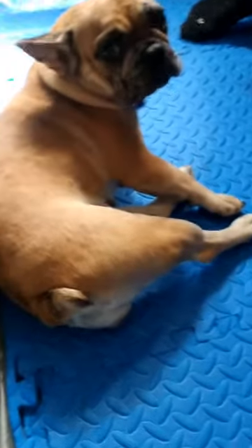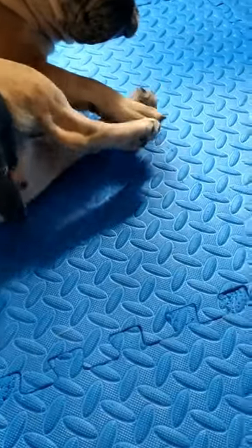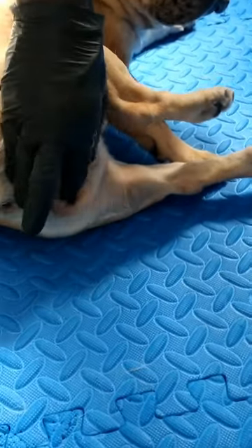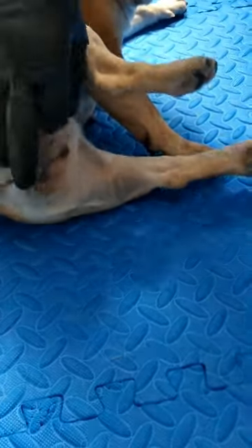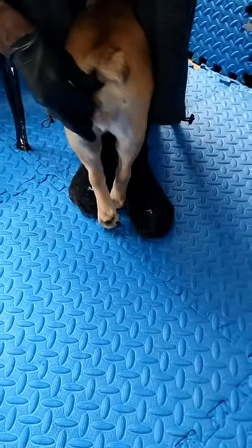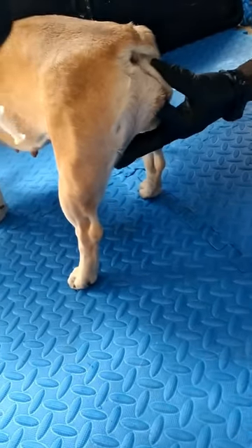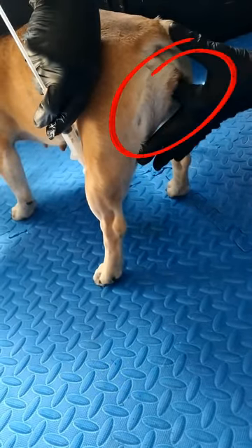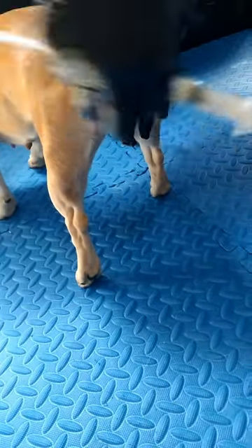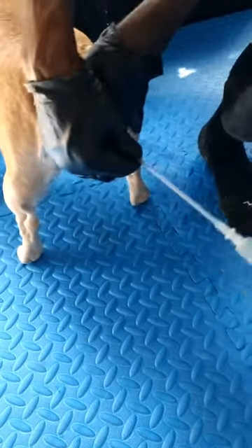He's collecting all of it in the syringe and now he's going to prep her, use some lube so the tube would be easier to slide in. He's going to do two different positions — this one most females are comfortable with. He's going to use his finger as a guide for the tube to know where he has to go for the insertion.